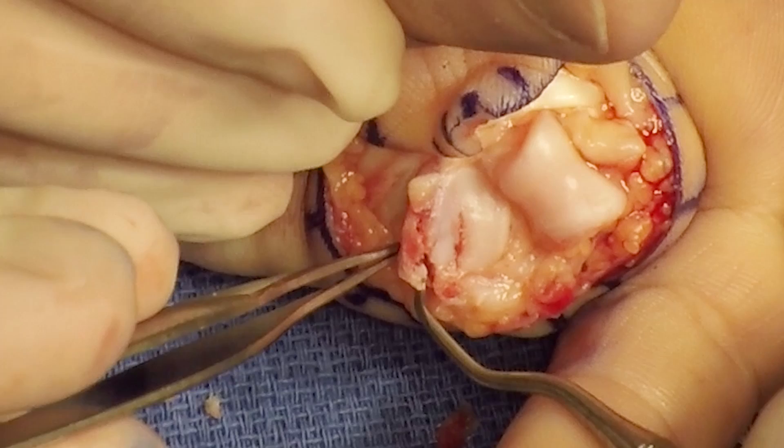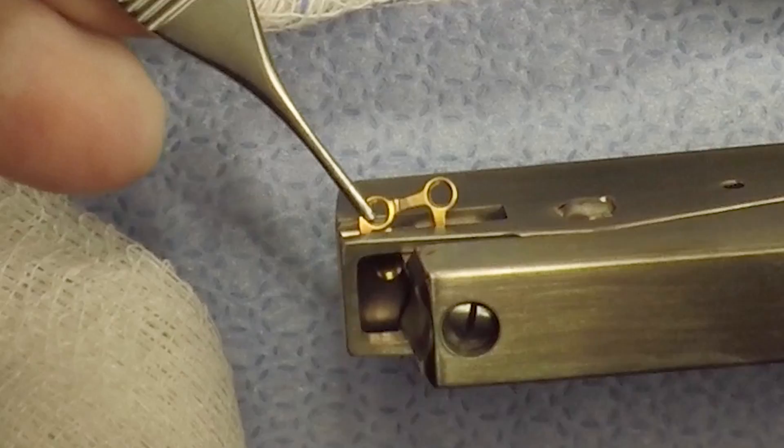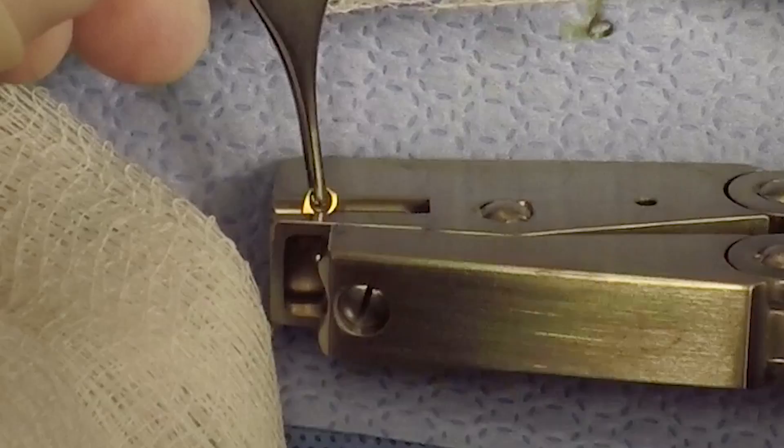I've not found bone grafting in these fractures to be necessary. I'm using a MedArtis 1.5 millimeter plate with 1.2 millimeter screws. I like the plate that has the more proximal extending transverse bar to give increased support for the volar rim. I trim the plate to reduce the amount of hardware which is used.